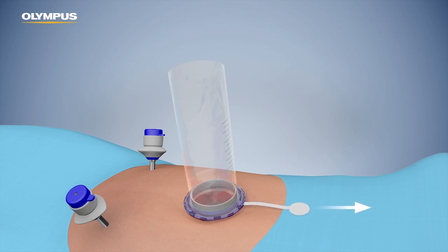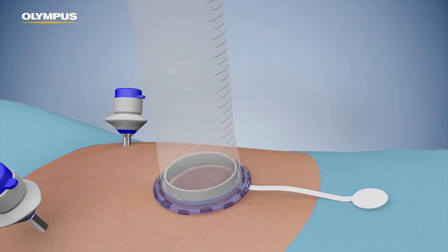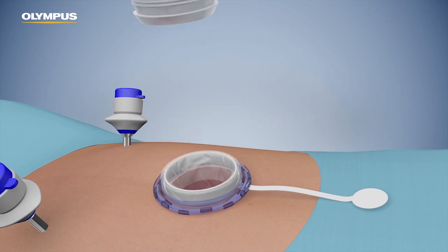Gently pull on the removal ribbon to remove the excess length from inside the incision. The retracting sleeve should then be trimmed six gradations above the proximal ring. Fold the remaining sleeve inside the proximal ring and connect the boot.